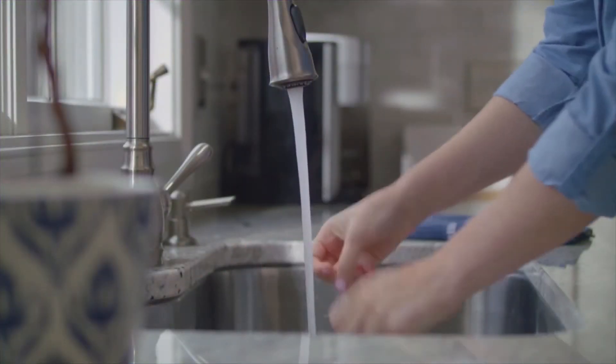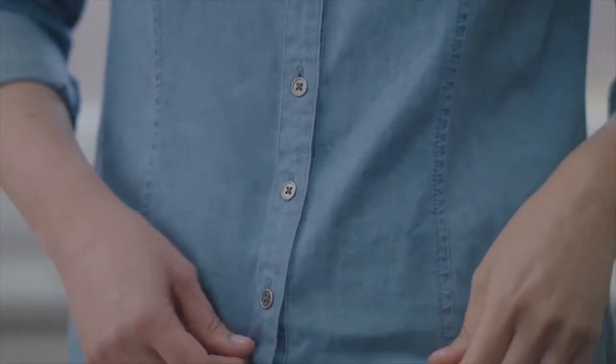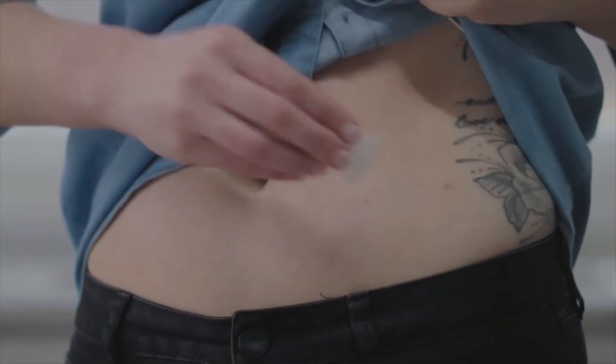First, wash and dry your hands. Choose a site to insert your sensor. Clean the site with rubbing alcohol and let it dry.